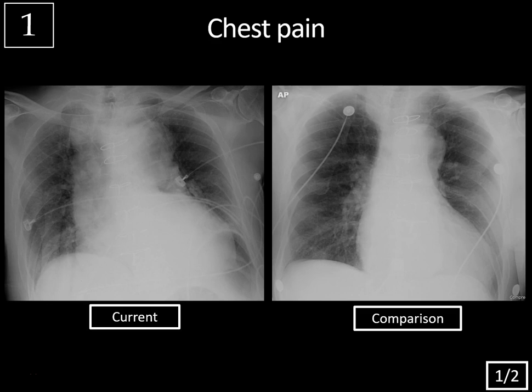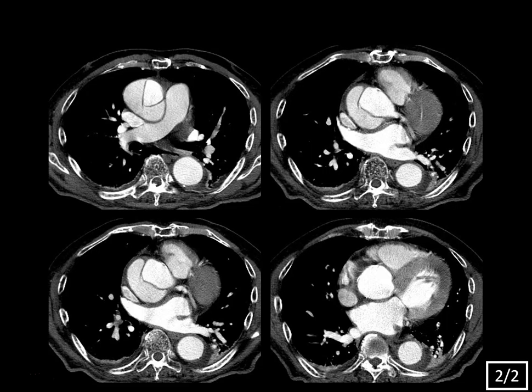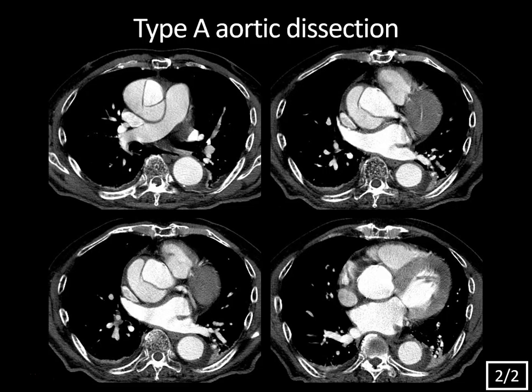Whenever you see a widened mediastinum, you should be concerned that there could be an expanding aortic aneurysm or an aortic dissection. The patient then had a CT angiogram of the chest, and indeed you can see that there's a type A aortic dissection.